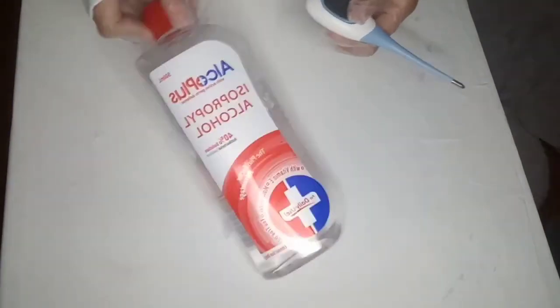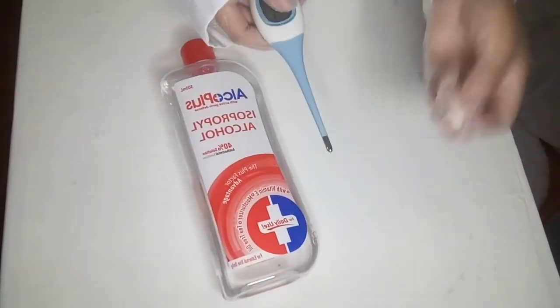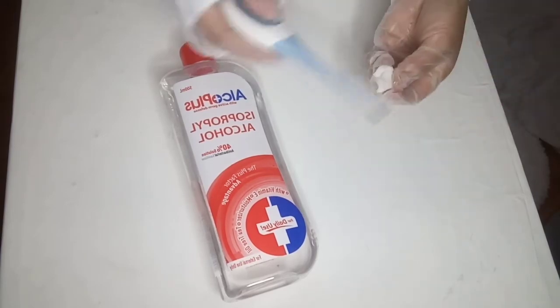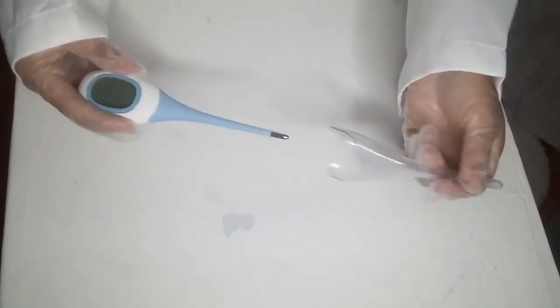It is necessary to clean the thermometer before and after each use. Clean the thermometer with a cotton ball and alcohol. The thermometer must be covered with a plastic case.